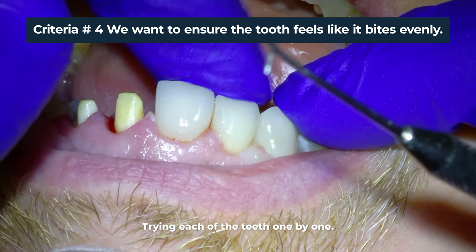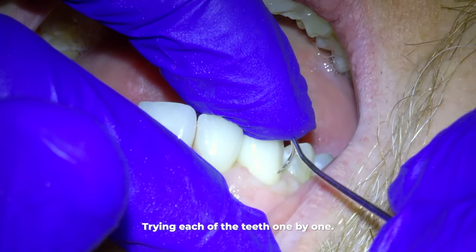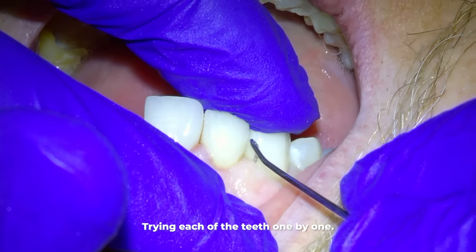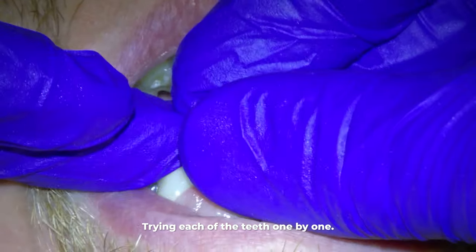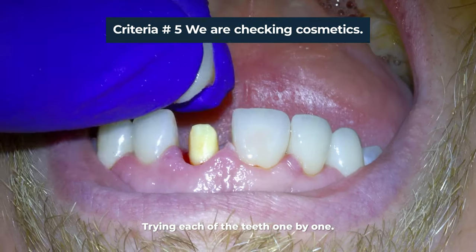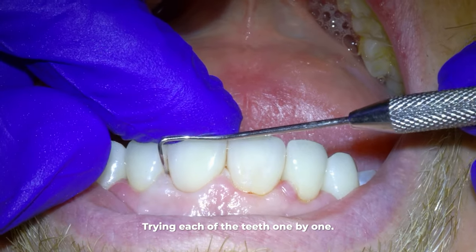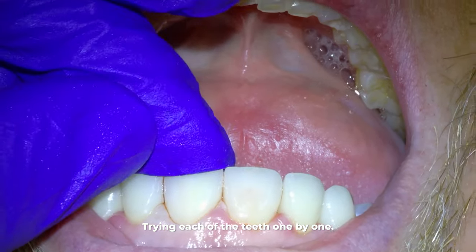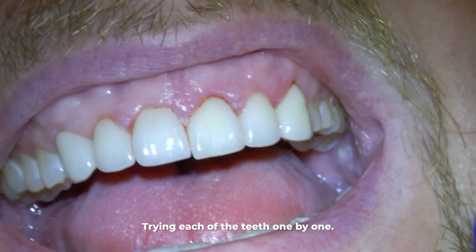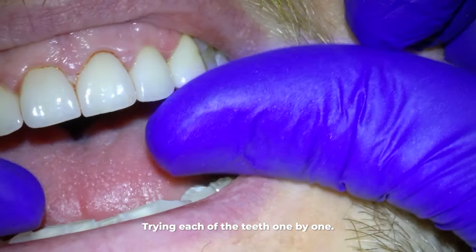Fourth, you want to ensure that the crowns feel like they bite evenly with the rest of the natural teeth. If the bite feels like it hits a crown before the natural teeth, then that tooth can become sore over time and possibly even loose, or even cause jaw problems. Fifth, we have to check the cosmetics. If the patient's happy and I'm happy, then that's all we got to do for the cosmetics. What you see me doing during all of this is checking and making sure the adjustments to those crowns satisfy the five criteria I've been explaining.